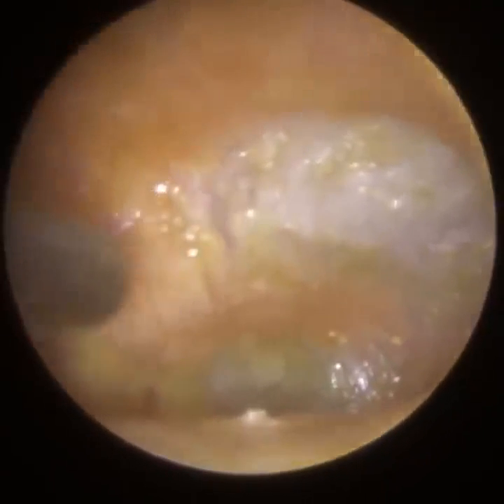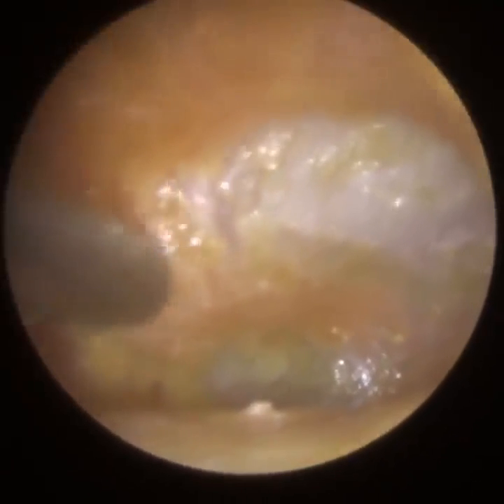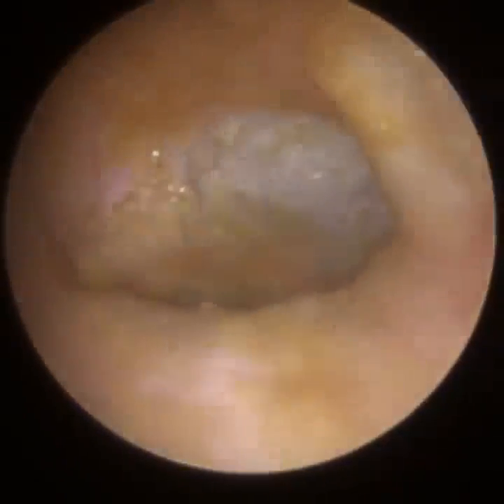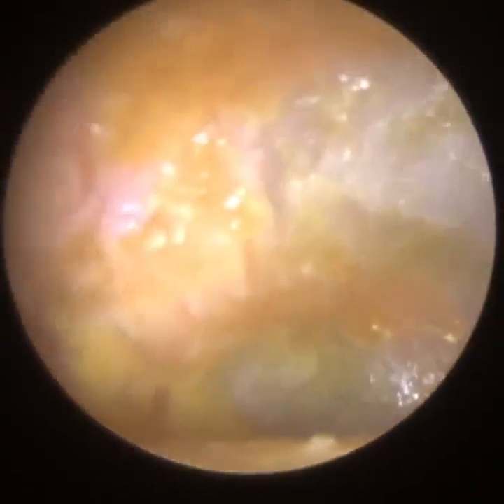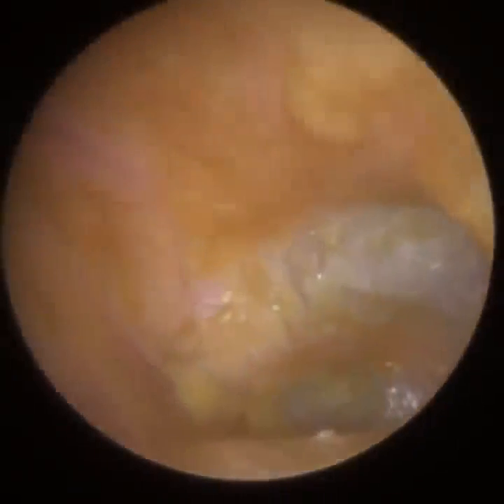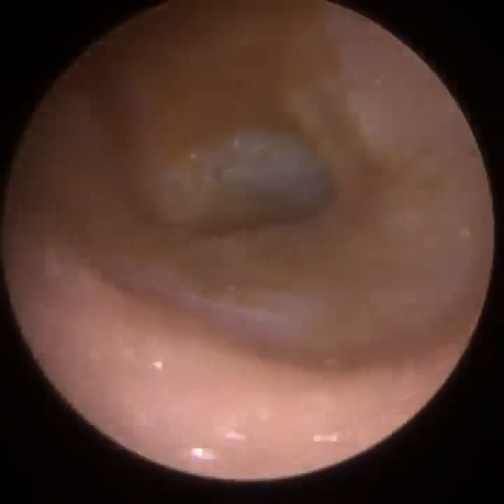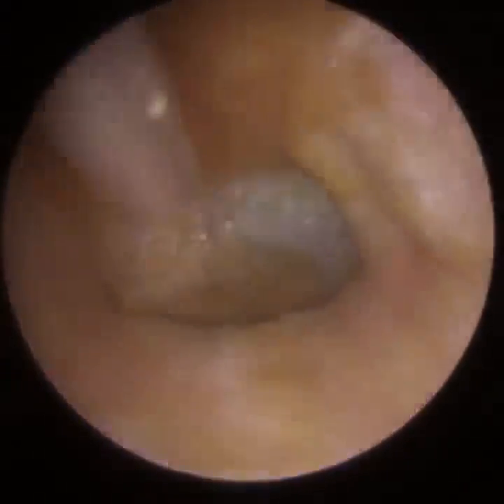I was always a bit skeptical. I said, well, there's no occlusion, there's no blockage, it's just dry skin in the ear canal. Is it best treating with medication, which is the norm? Or is there any point me trying to suction it, because we could sometimes make things worse if we cut into the ear canal wall, because we are moving stuff off the ear canal wall, especially the bony part.